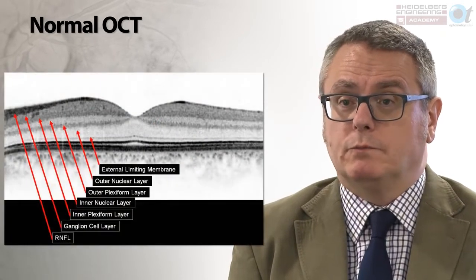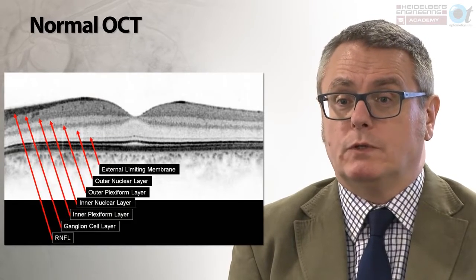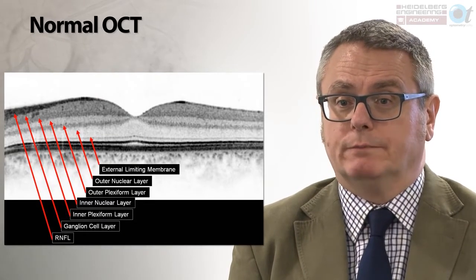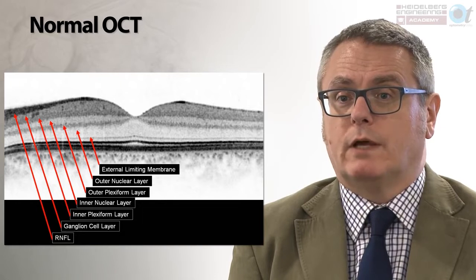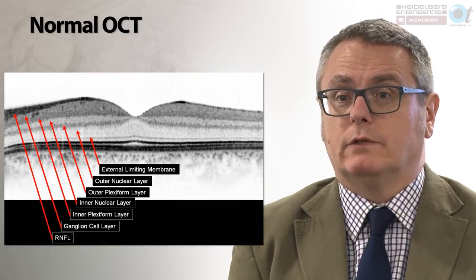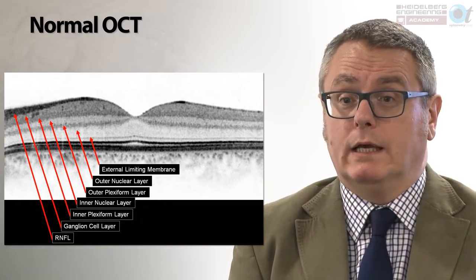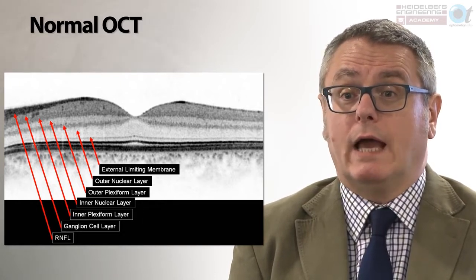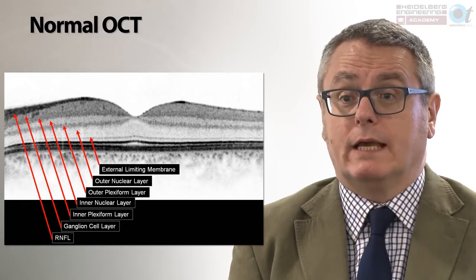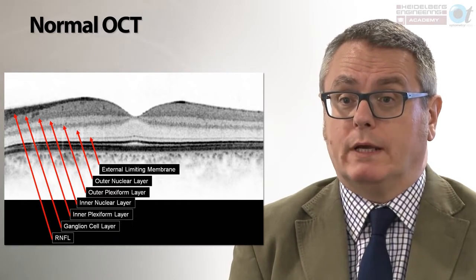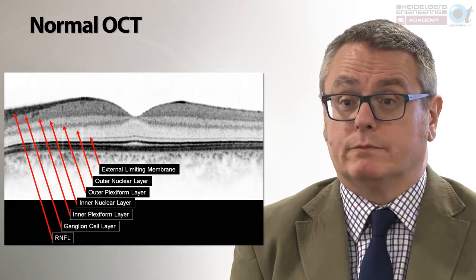There is good correlation between all OCT devices for inner retinal structure. Going from the retinal nerve fibre layer through ganglion cell layer, inner plexiform, inner nuclear layer, outer plexiform, outer nuclear layer, and finally the external limiting membrane, which represents the apical aspect of the Müller cells.